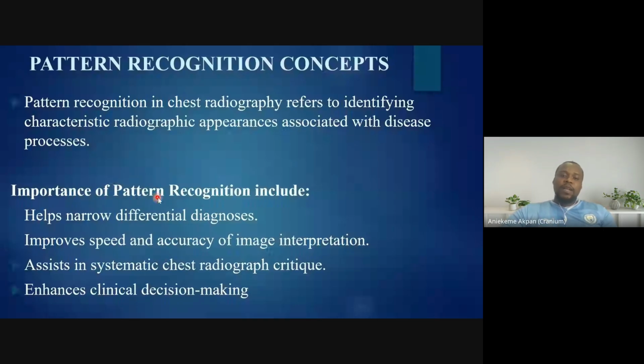So the importance of pattern recognition will include: it helps to narrow differential diagnosis. It improves the speed and accuracy of image interpretation. It assists in systematic chest radiograph reading, because there are even some things that the doctor might not query.